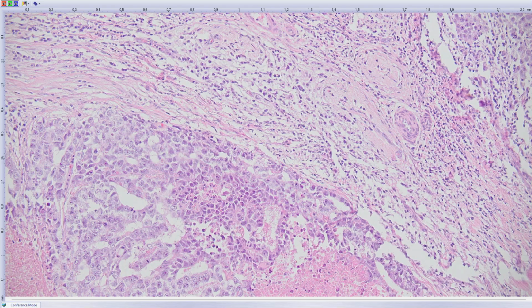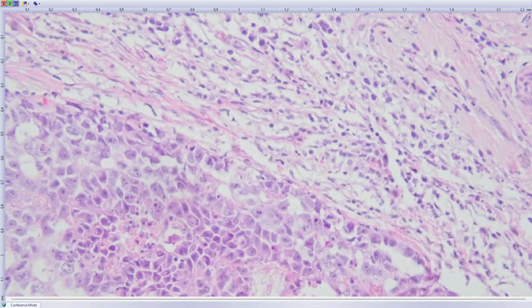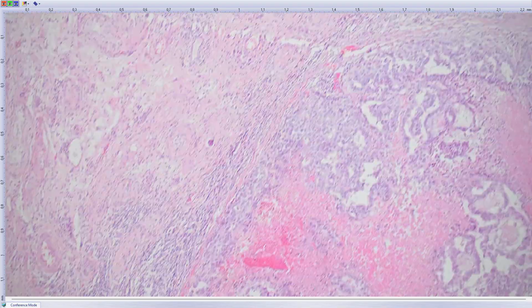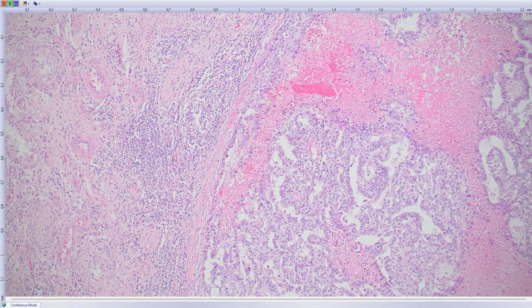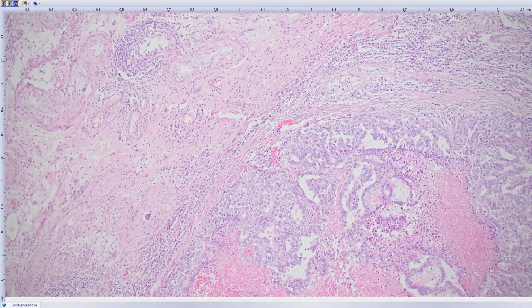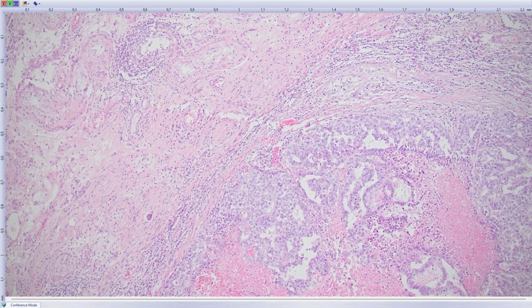There might be really tumor. I was not sure whether it's inflammatory, but. So these eosinophilic deposits around the cells are considered to be incipient differentiation. These collagen-like deposits. You will see it later.